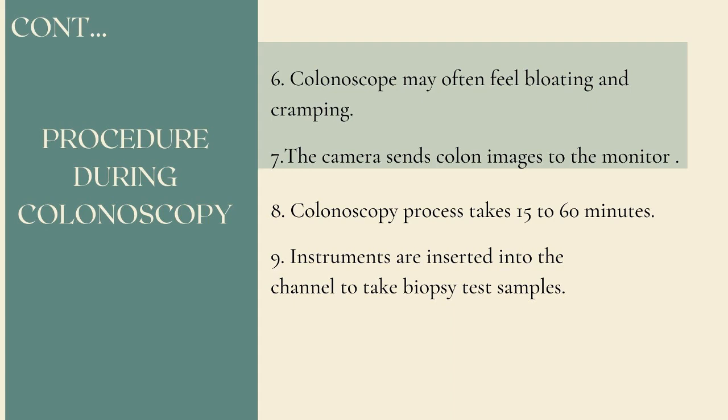If the entire colon for some reason cannot be visualized, the physician may decide to try colonoscopy again at a later date with or without different bowel preparation, or may decide to order an X-ray or CT of the colon. The doctor can insert an instrument through the channel to take a biopsy, that is, a tissue sample, or remove polyps or other abnormal tissue. This is the procedure for colonoscopy.